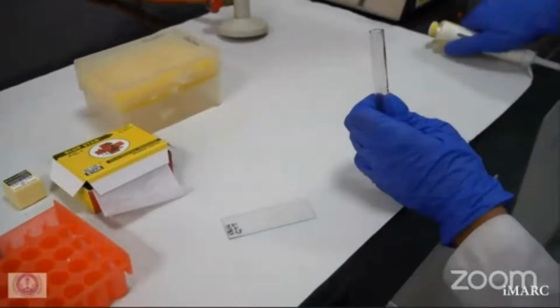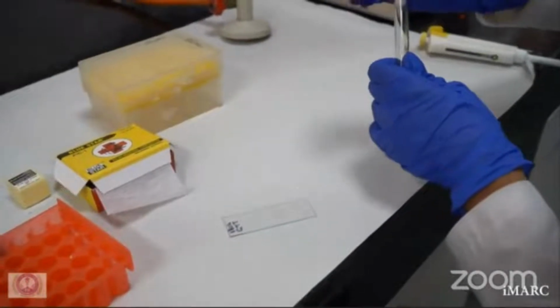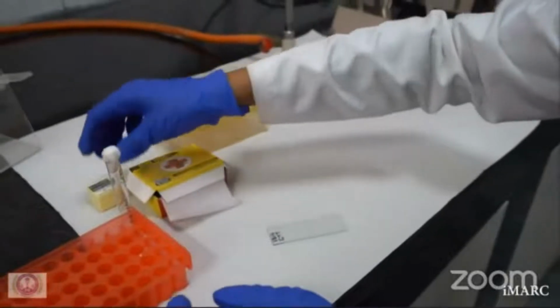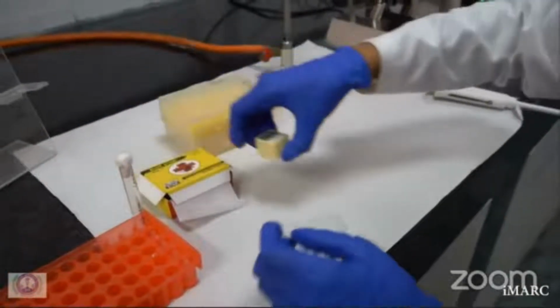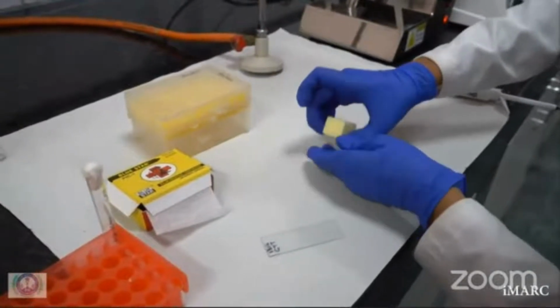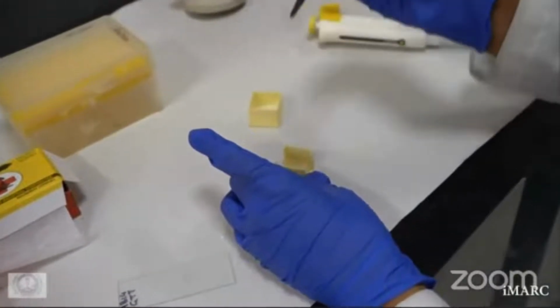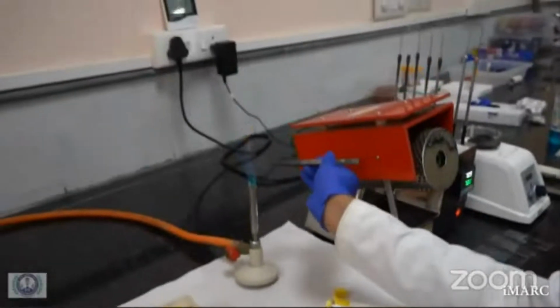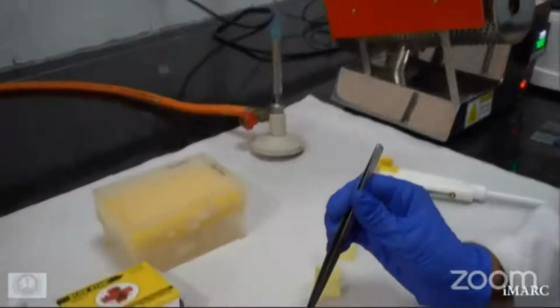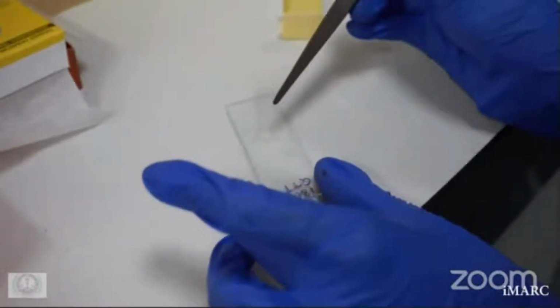Please note that the germ tubes will have parallel walls at their point of origin and are not constricted. To record a positive, about 30% of the cells should show germ tube production. Also, controls should be used: a known strain of Candida albicans as positive control and Candida tropicalis as negative control.